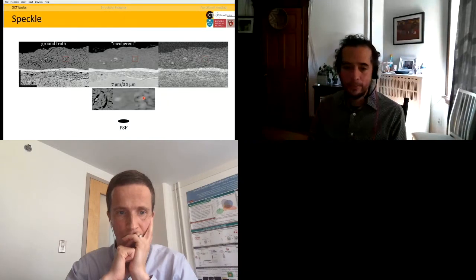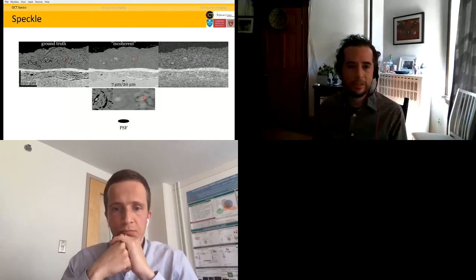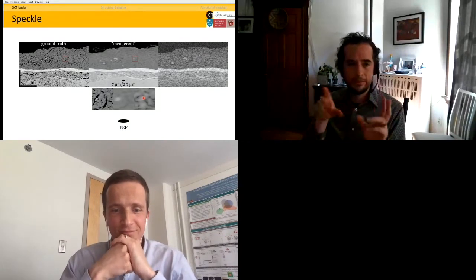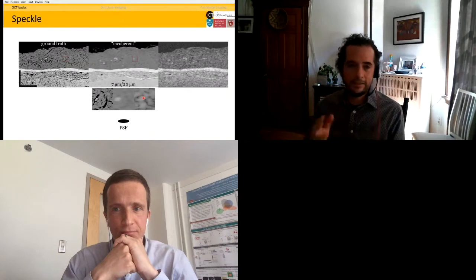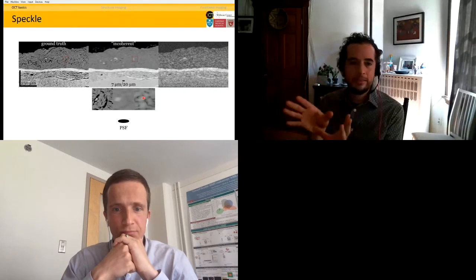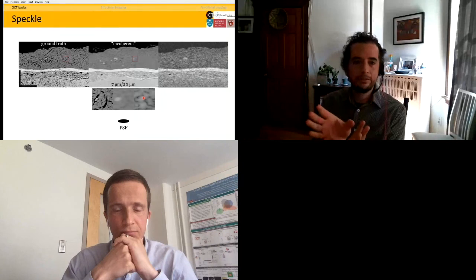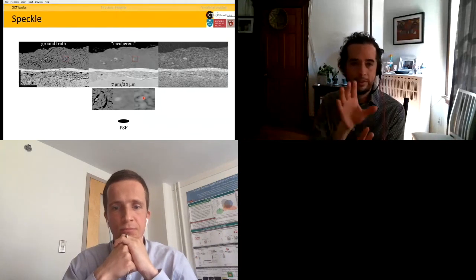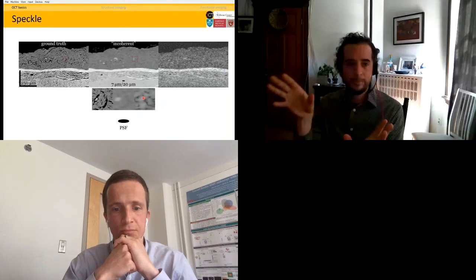So if we had a way to shake the scatterers around in the tissue to essentially change the microscopic organization, we would create different speckle patterns. And this is exactly what I'm showing here on the right. I hope that you can see this. So all of these speckle realizations are completely compatible with exactly this incoherent image. So a single incoherent image can be associated with an infinite amount of speckle patterns.